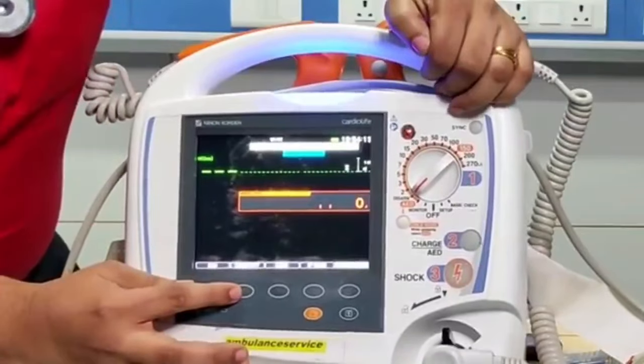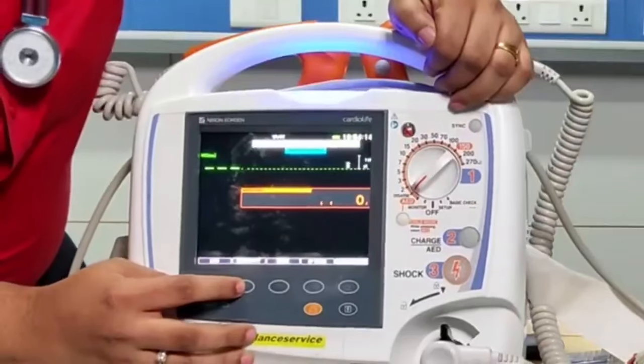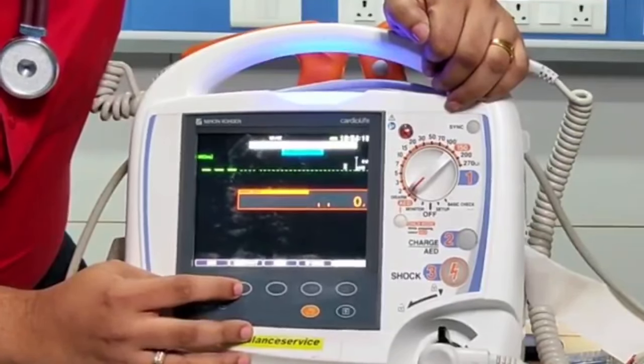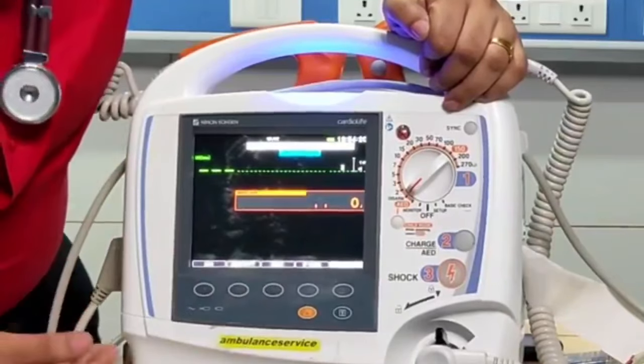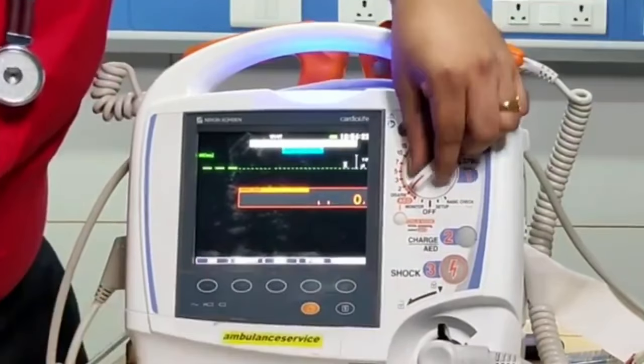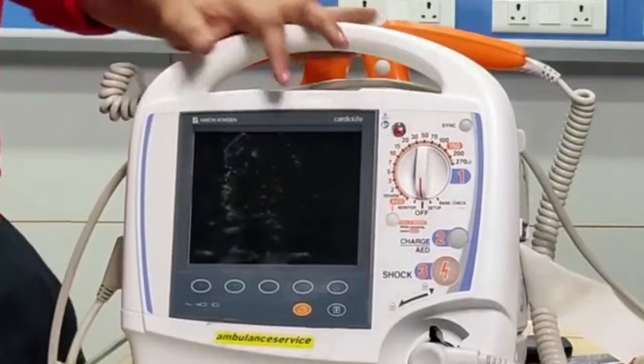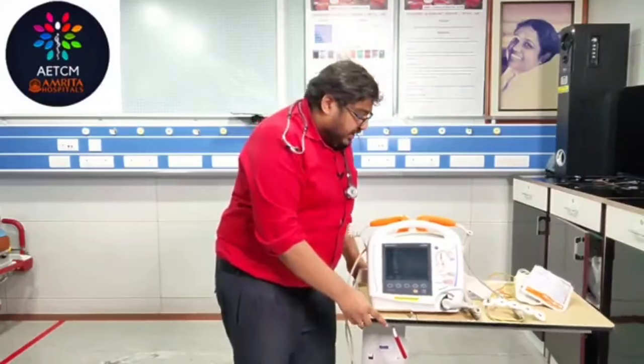And sometimes in case of fine VF, we will not be able to identify the fine VF, so we can increase the sensitivity here. 0.2, 0.5, 2 millivolts. So it can increase as well as decrease, and there are various other buttons which can help you in retrieving the data and all those things. So these are the basic parts of your defibrillator.